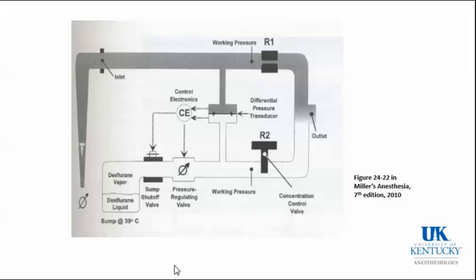And then by a complicated system that we won't go into today, again, the same idea, it mixes this highly concentrated vapor with the fresh gas flow to generate the concentration that you want. And the various slides that are in this set go into more detail if you wish to know about it, and also the textbooks.